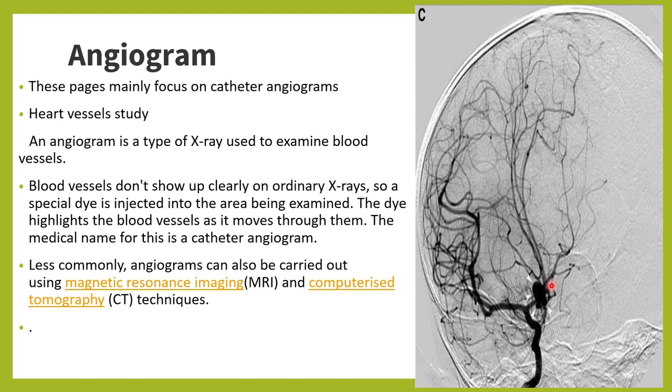Sometimes we also carry out angiograms by using MRI or CT. That facility is also available nowadays: CT angiogram, MRI angiogram, etc. But when we take x-rays through the contrast dye, that process is called the catheter angiogram.